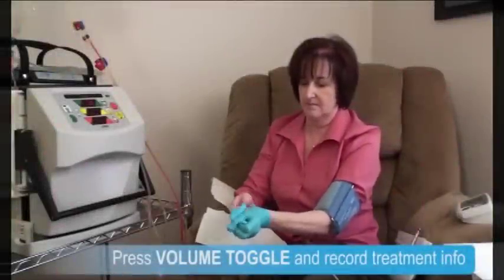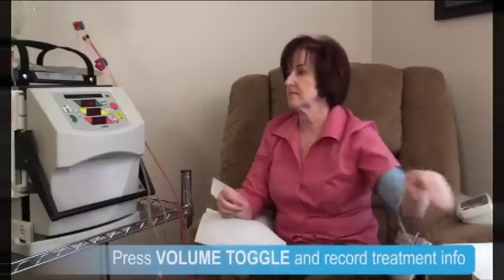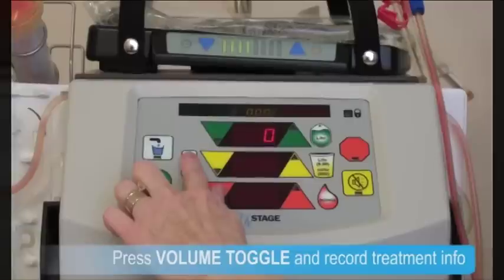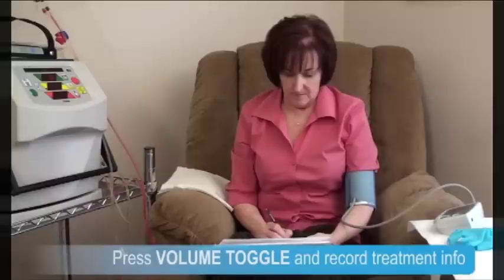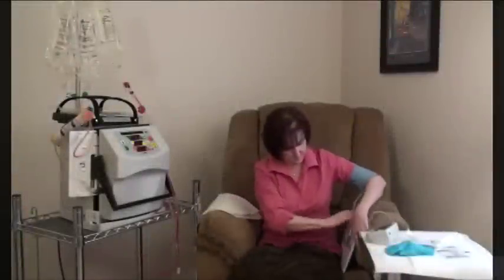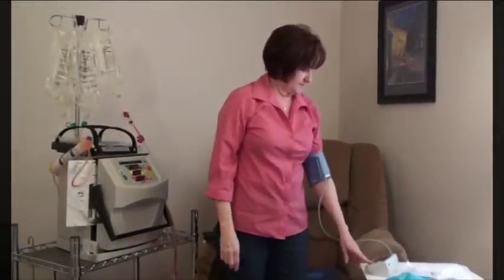She takes a moment to press volume toggle and write down her treatment information. She notes her treatment time, dialysate delivered, ultrafiltration removed, and blood volume processed. Lois takes a moment to take her standing weight and blood pressure, and records them on her post-treatment assessment.